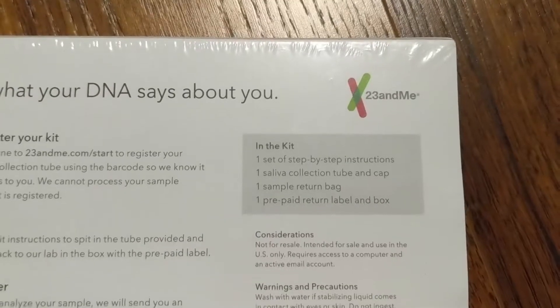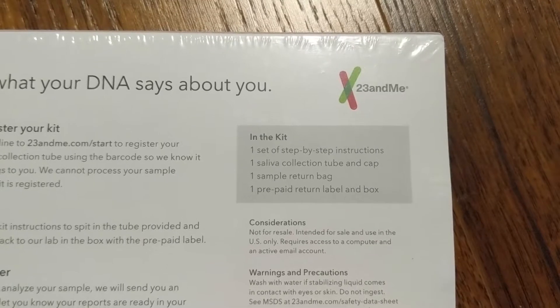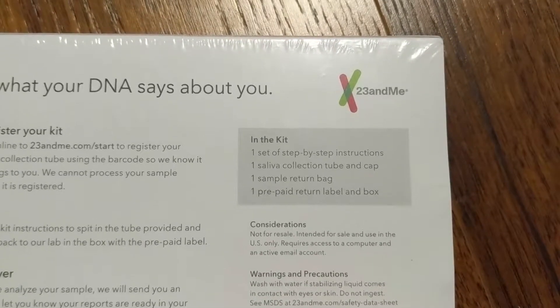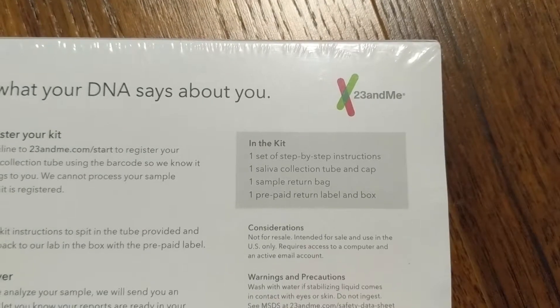Inside it has one step-by-step instructions, one saliva collection tube and cap, one sample return bag, and one prepaid return label and box.